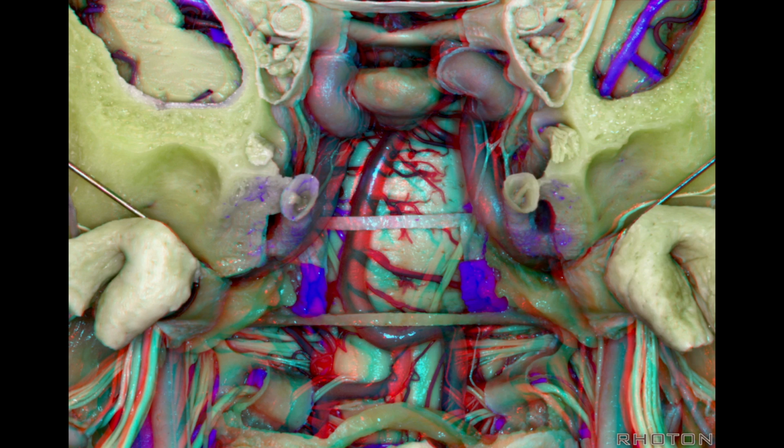What do you think? Vidian nerve again. All of the early descriptions of Vidian nerve surgery said sacrifice it. That can lead to a dry eye, but I think we'll see it become more common in the future to not sacrifice it, but actually to drill it out and preserve it. Here it is in its canal, just like the hypoglossal nerves are preserved in their canal.